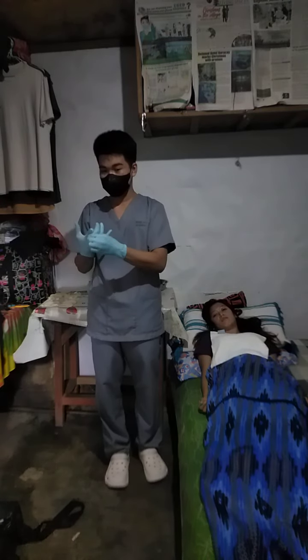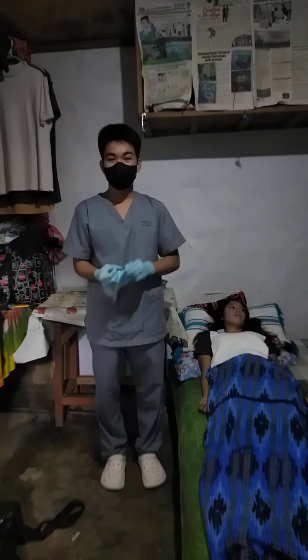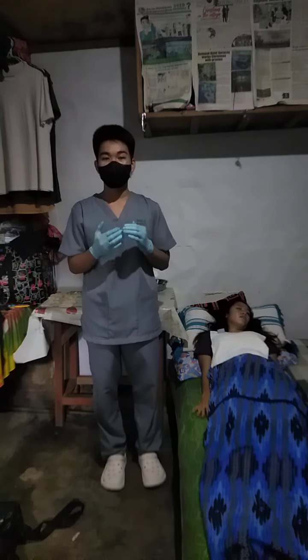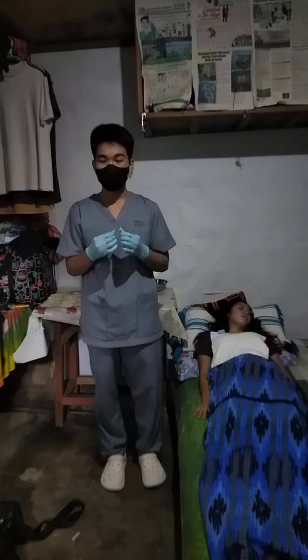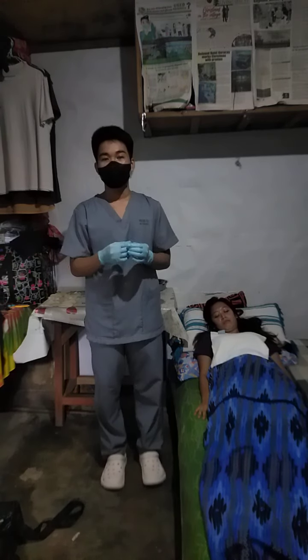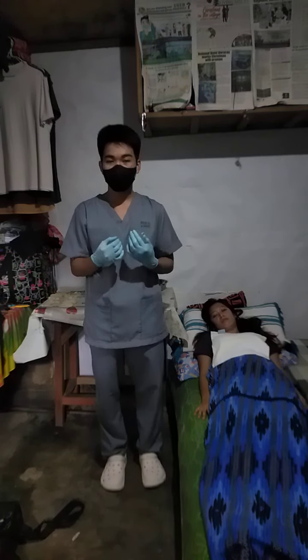Next is to measure the distance to insert the tube by placing the tip of the tube at the patient's nostril and extending to the tip of the earlobe and then to the tip of the xiphoid process. Then mark the tube with an indelible marker.